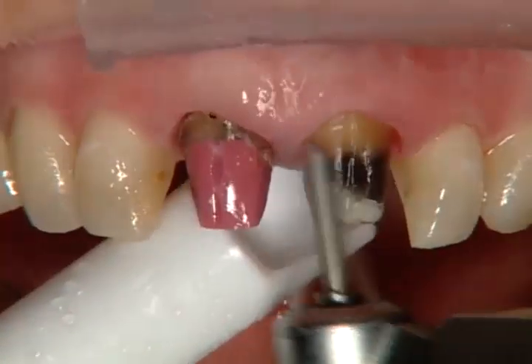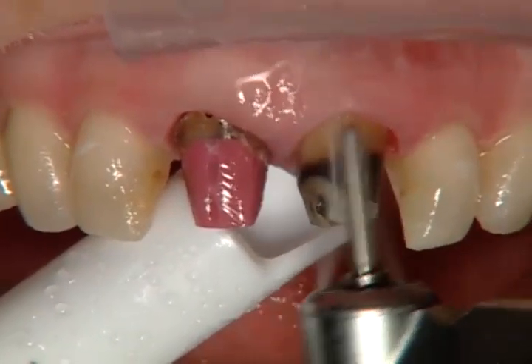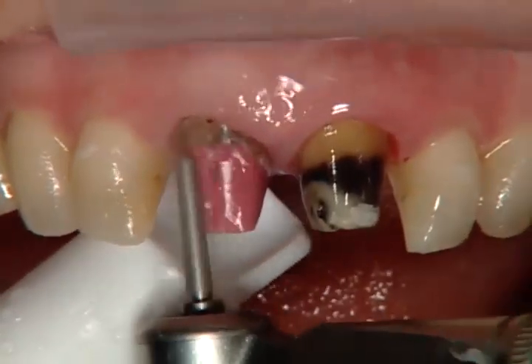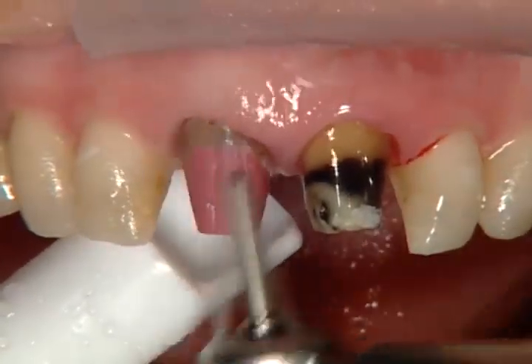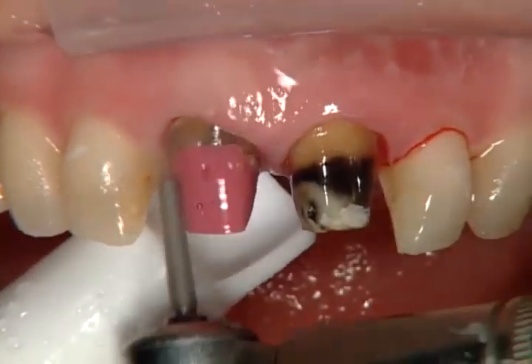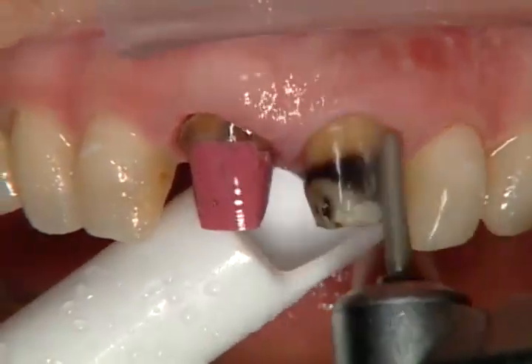We can't do the reverse preparation technique on these teeth because of the fact that they already had crowns on them. So we're just going in right now and smoothing up some stuff, blending the cut I had on the facial from when I went and removed the old PFMs there from the razor burr, and just smoothing off the old cement, kind of seeing how hard these teeth are and getting a feel for what these preps are going to feel like.